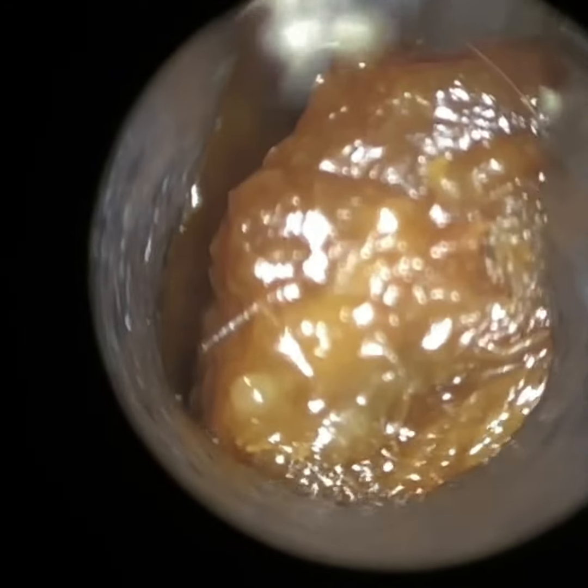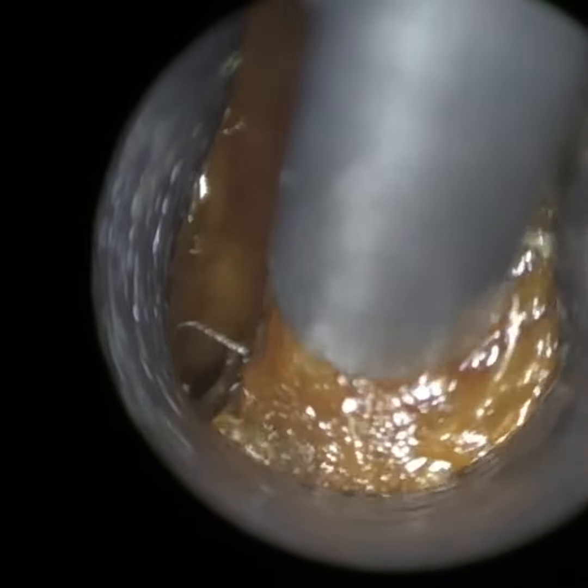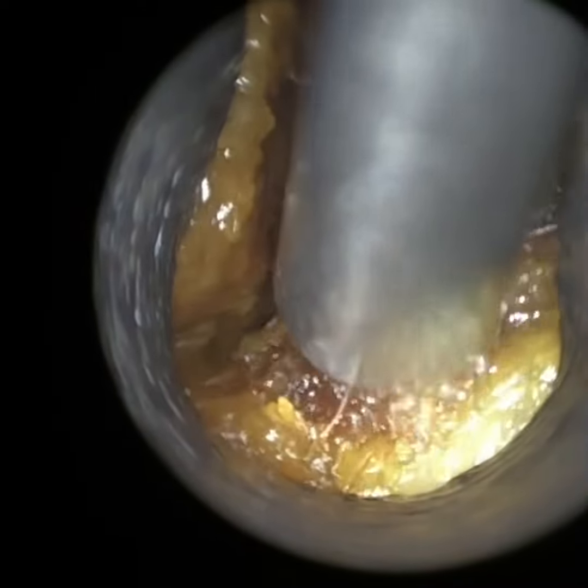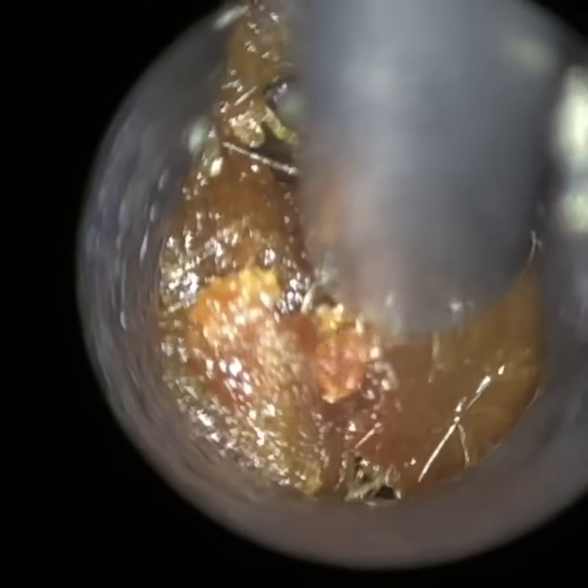Same patient — this is just their right ear. This ear was semi-blocked with wax. They did have some wax laterally, like this piece here, and there's a lot more wax further in the ear, up against the eardrum. We've just adjusted the focus so we can clearly visualise the wax more on the outer third, the cartilaginous portion. On a couple of occasions the wax blocked the suction tube, so I had to come out and unblock it — eventually using a cleaning rod to push through the suction probe. You can just see that focus, the magnification, the clarity in view — it is quite striking.